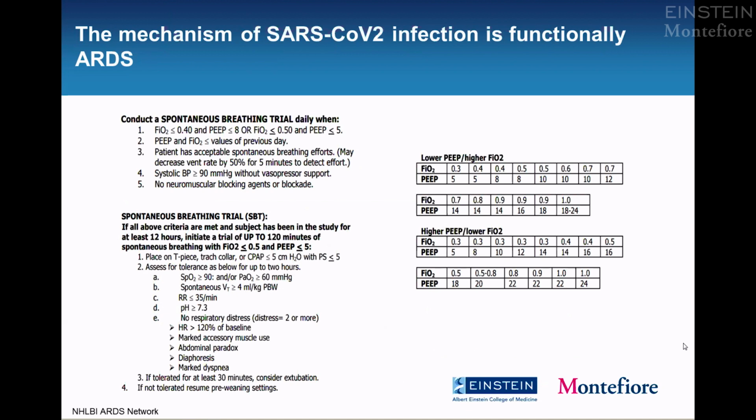So Dr. Reddy touched on this, and I won't go through it in too much detail. I just want to present the fact that ARDSnet, the NHLBI ARDS network, has produced documents that can be very helpful to keep as pocket cards for how to approach weaning in these patients. And this is a strategy that our respiratory therapists often follow. When I mentioned before that you want to follow a stepwise decrement in PEEP or FiO2, this is what I meant.